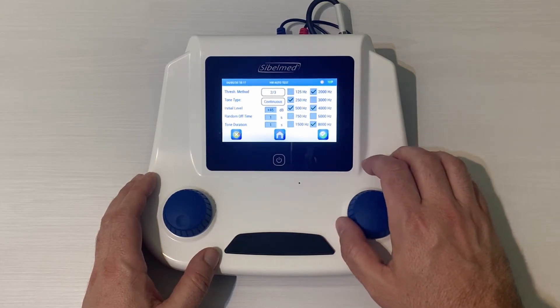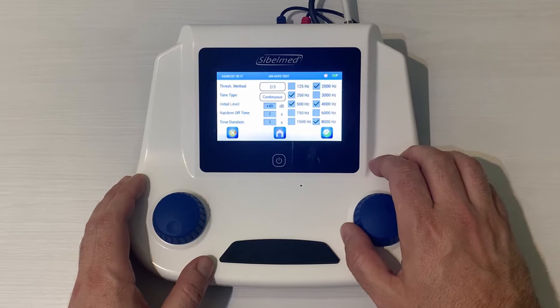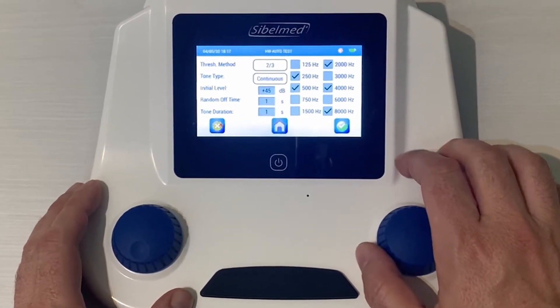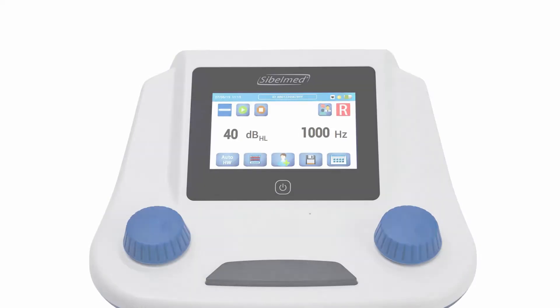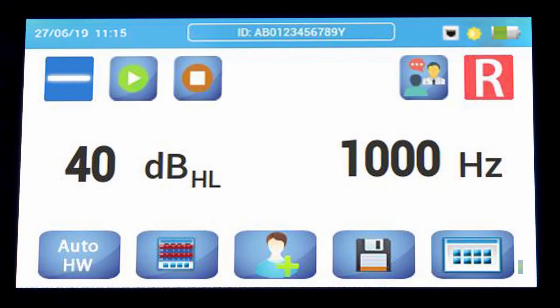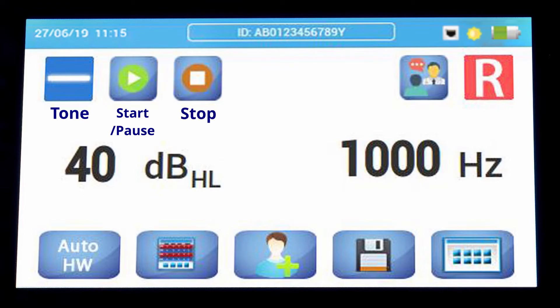The 1000 Hz frequency is always examined and does not appear on this screen. To start the automatic test, select the mode from the main menu. This screen will show the type of tone, the start/pause by the play icon, and the test stop. On the right there is the familiarization icon and the channel selection, left or right.